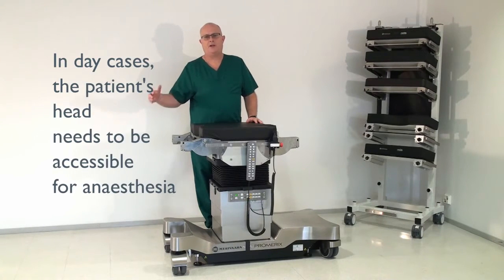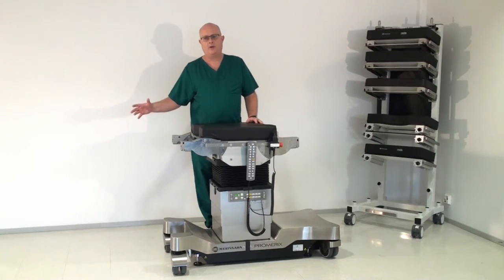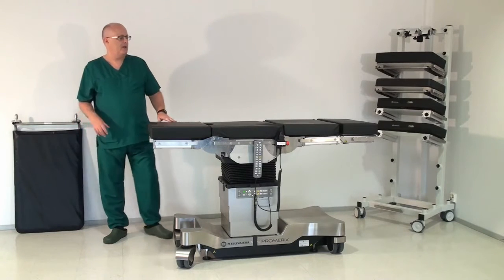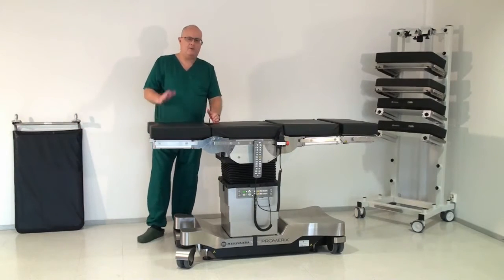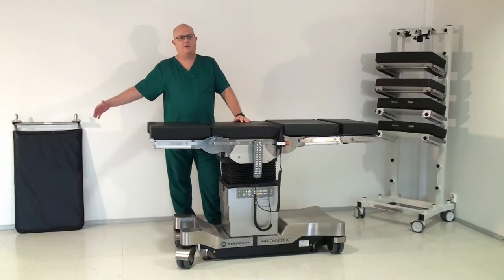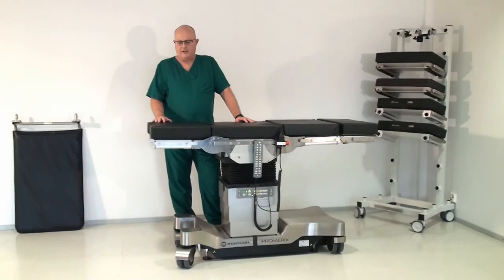is to make sure that the patient's head is accessible for the anaesthetist when using a laryngeal mask or a laryngeal airway. Okay, here we have a normal table set up, ready for gynae or urology as the table would normally come. So from the main body of the table, we have two 40 sections and a head section, and you might finish this off with a 25 section at the end. And this is how most people would buy and configure the table.